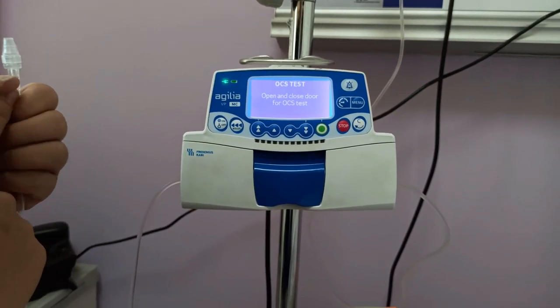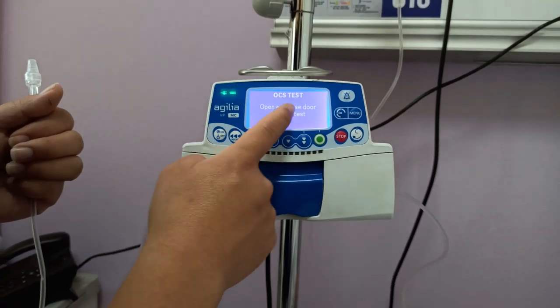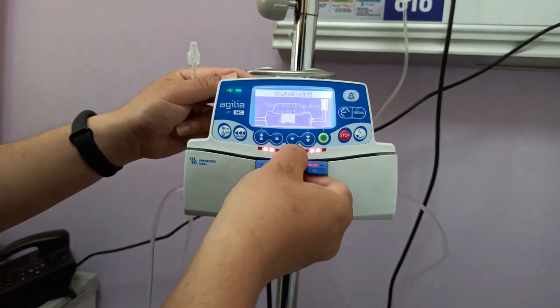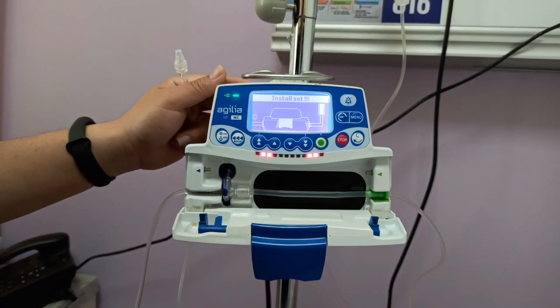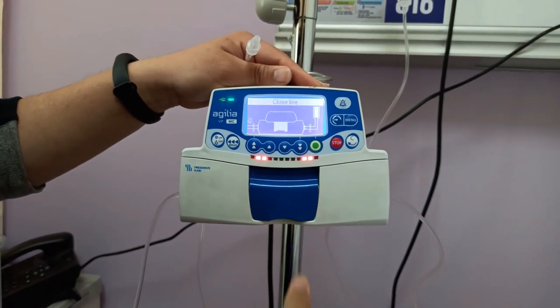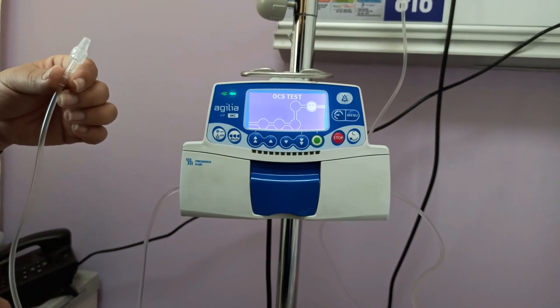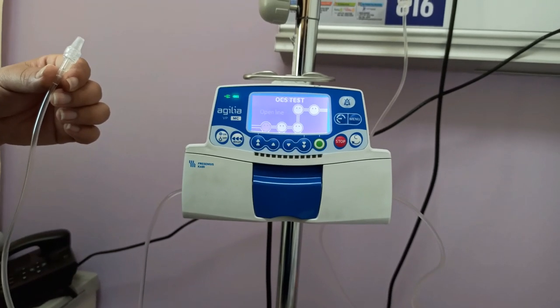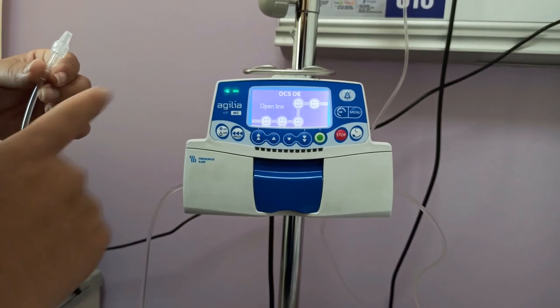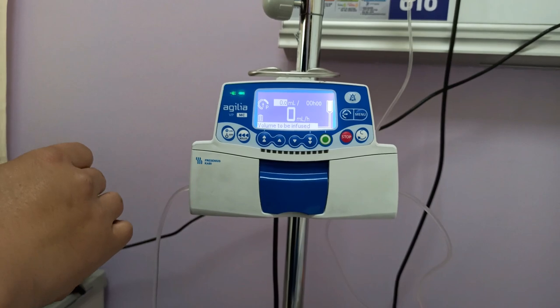Once priming is done, release the bolus button and the pump proceeds to the OCS test. It instructs you to open and close the door for the OCS test. Pull in the lever and pull the door to open, then push the door and push the lever to close. The OCS test starts and completes successfully.